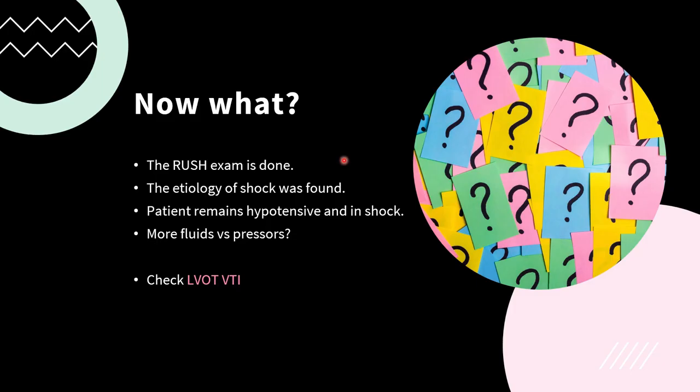So now what? The RUSH exam is done. You found the patient's etiology of their shock. They're still hypotensive with inadequate tissue perfusion. Should you give more fluids or start pressors? Well, the RUSH exam is great for diagnosis, but it doesn't provide information on treatment.